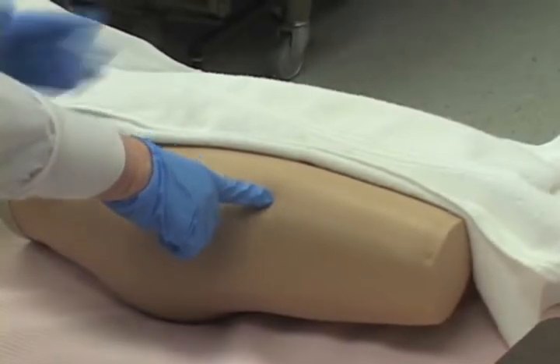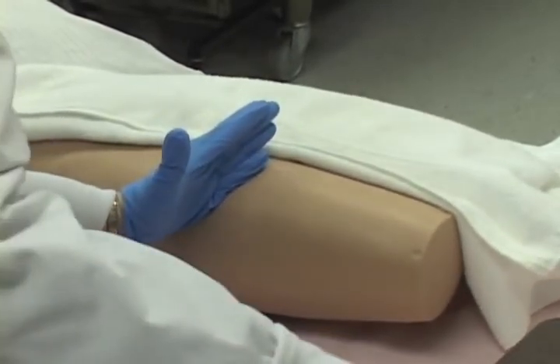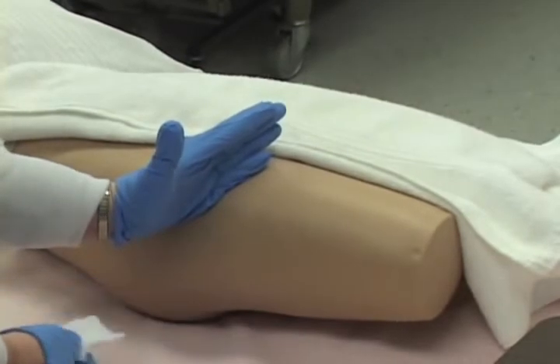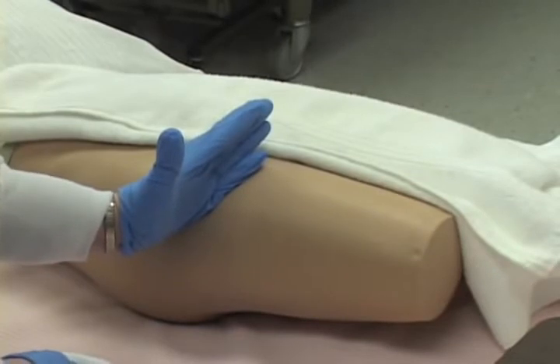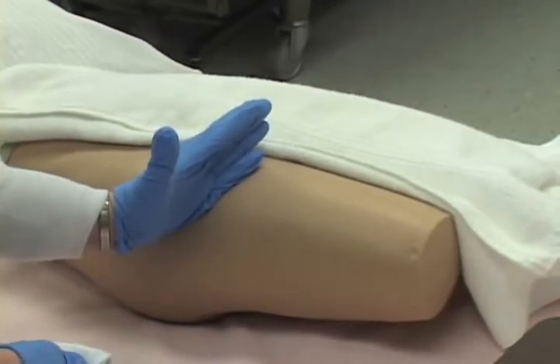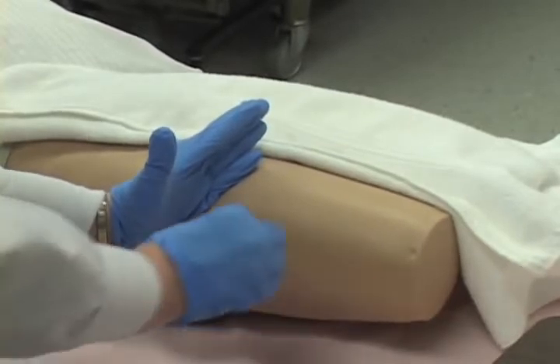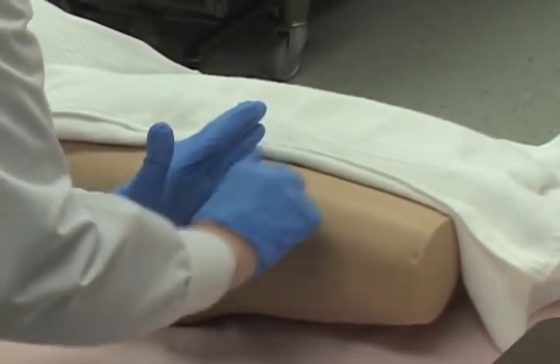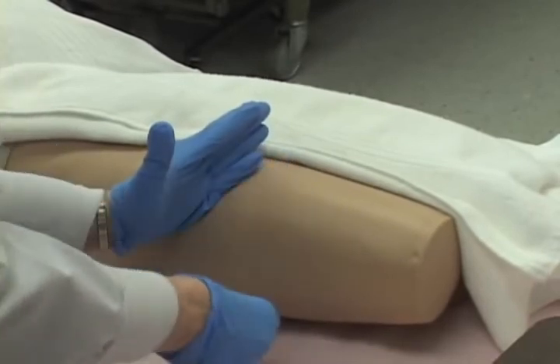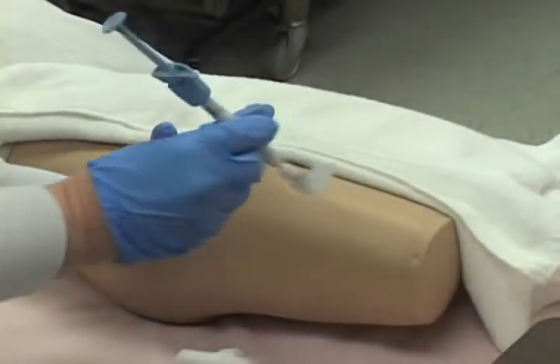Use your non-dominant hand to displace the skin laterally by pulling it 1 to 1.5 inches away in any direction from the intended injection site. It is important to not release the displaced tissue until after the medication has been injected and needle is removed. With your non-dominant hand, cleanse the intended injection site thoroughly with an alcohol wipe. You will use a gauze pad in the lab, in a bullseye motion working outward. Keep your non-dominant hand in place to maintain tissue displacement.